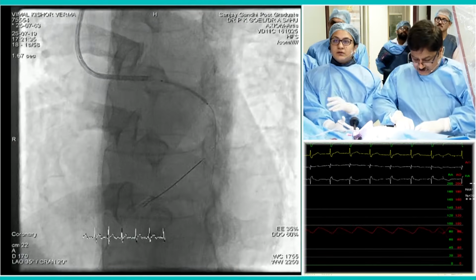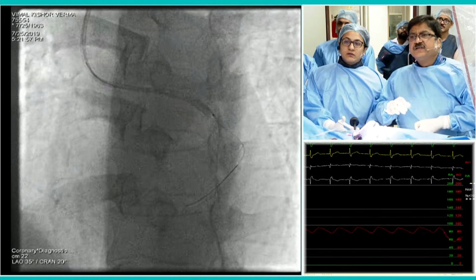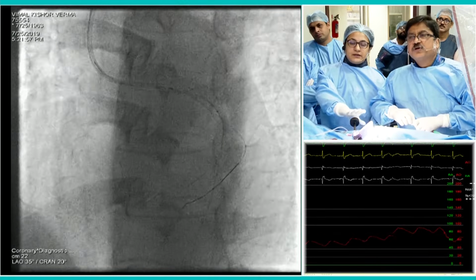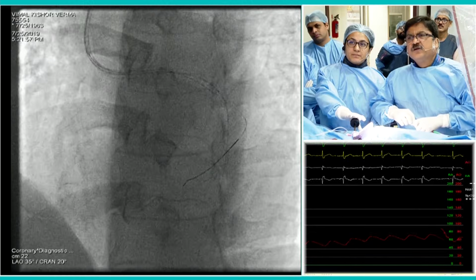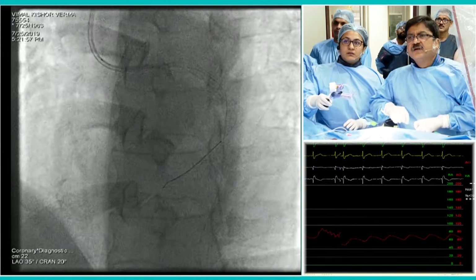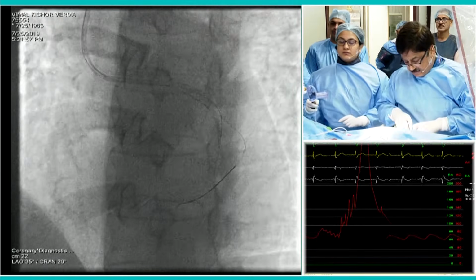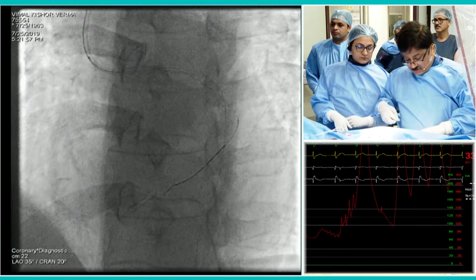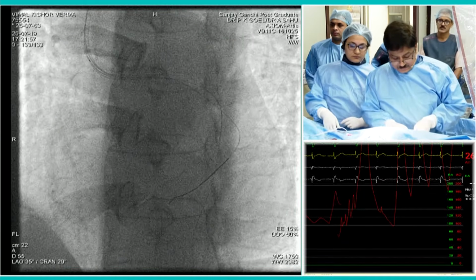This stent actually has medication only on the abluminal side, so the total drug load is less, and probably with that you could have fewer thrombotic events. Although now the stents are pretty good, I think, with thinner struts and less drug.